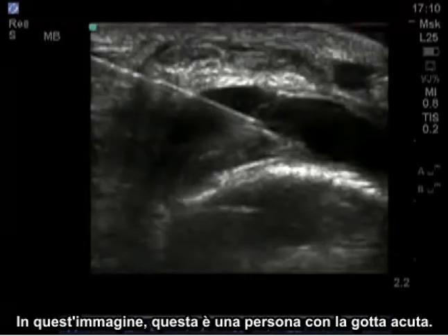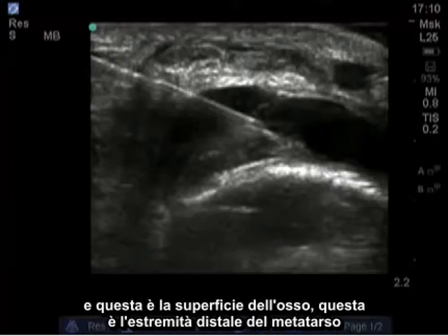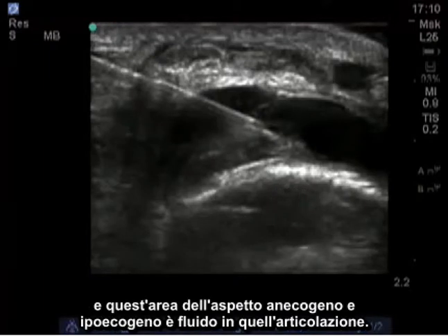In this image, this is a person with acute gout. We have a transverse image of the left first metatarsophalangeal joint. This is the bone surface — the distal end of the metatarsal — and this area of hypoechoic and anechoic black appearance is fluid in that joint.